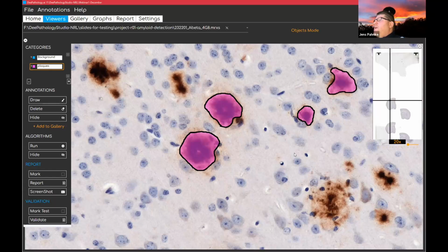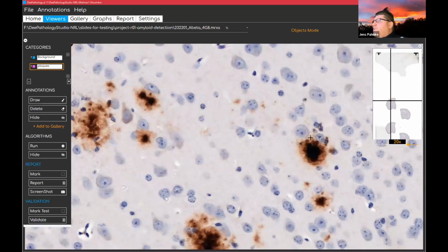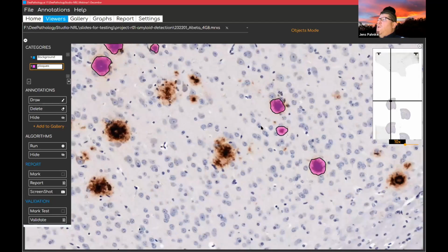So I choose a few. I need a few to give some examples. We have one here. That's also very nice. So we go for this here. In the start, it takes a few seconds to do this. Also, we can use a smaller one here and go around. And you see it like this and the bigger one. So usually I take 5 to 10 examples in the start. So then we have this here.